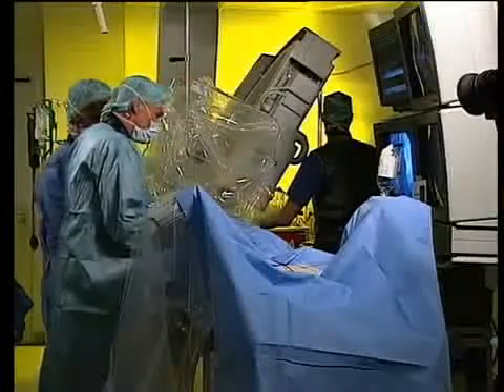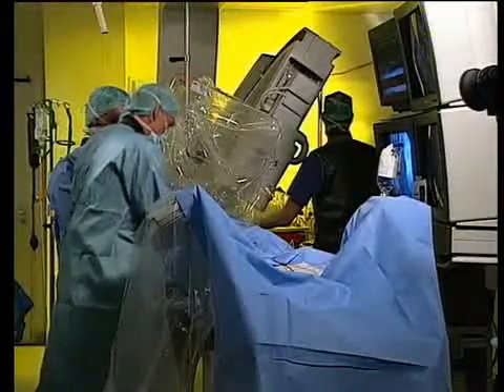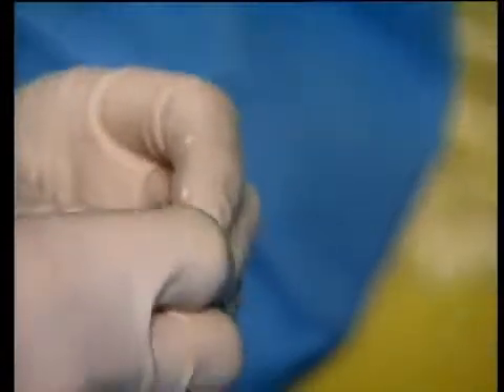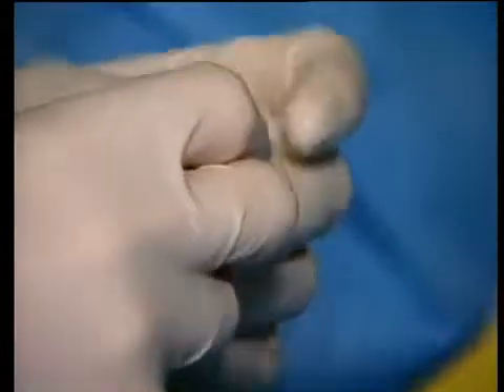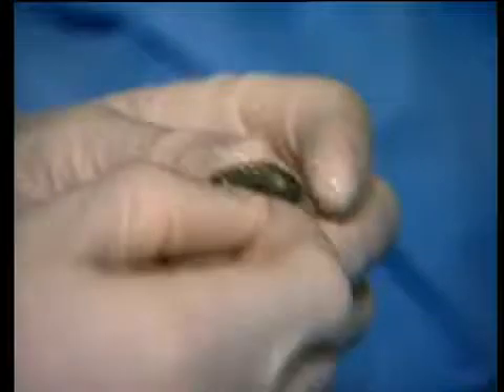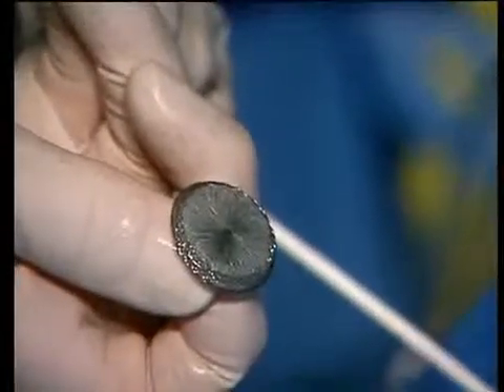And it's made of nitinol, yes? Yes, it's made of nitinol. Is there a difference regarding the thickness of the wire compared to the Amplatzer devices, or is it the same? It's 80 wires. The Amplatzer comes with different amounts of wires depending on the diameter, but this is 80 wires. And the attachment mechanism is the same?